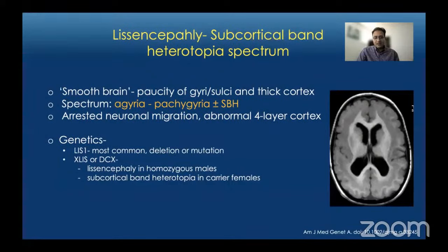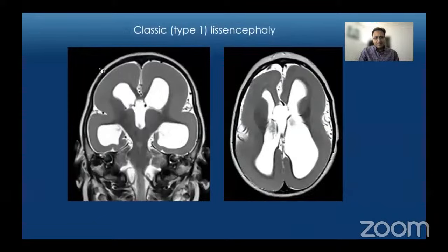Our case was a three-year-old female with pachygyria and subcortical band heterotopia. This is an example of classic lissencephaly where you have a smooth brain with diffuse thick cortex and very shallow sylvian fissures giving it a figure-of-eight appearance.